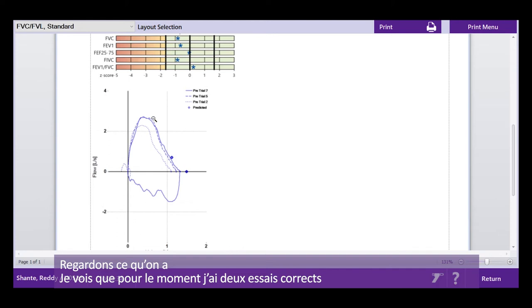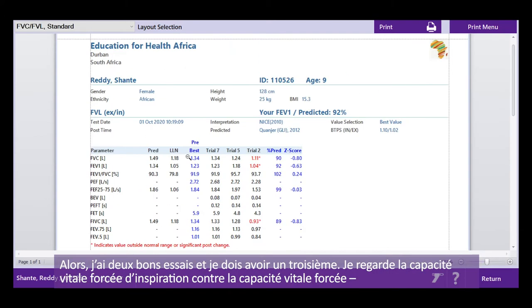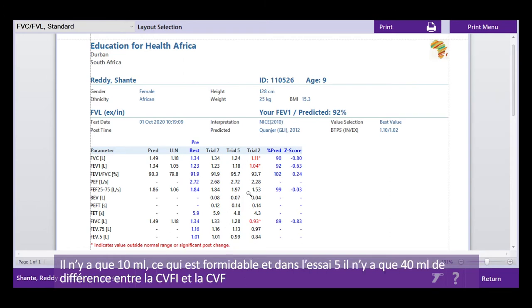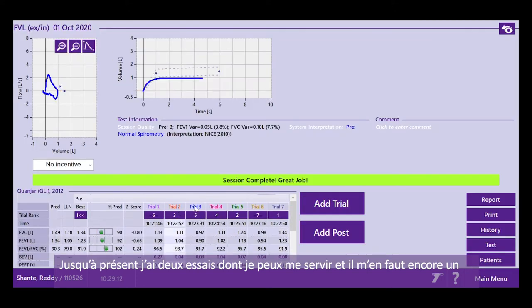So what I'm seeing at the moment is that I've got 2 reasonable blows, okay? The third blow is not as good as what I would want it to be. You can see that she didn't breathe into total lung capacity and that she's got a little hesitation on that one. So I've got 2 good blows and I need to get 1 more good blow. I'm looking at my forced inspiratory vital capacity against my forced vital capacity. There's very little difference in the best one here. There's only 10 mils, which is great. And in trial 5, there's only 40 mils difference between the FIVC and the FVC. So far, I've got 2 blows that I can use, and I'm looking for 1 more blow that I can use.